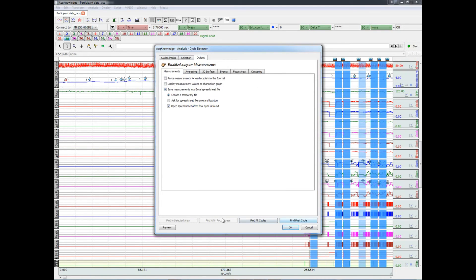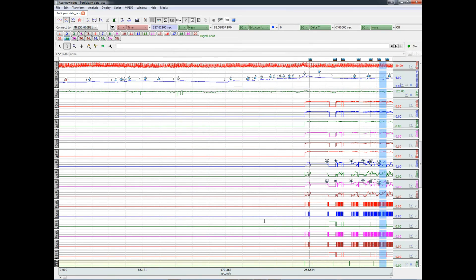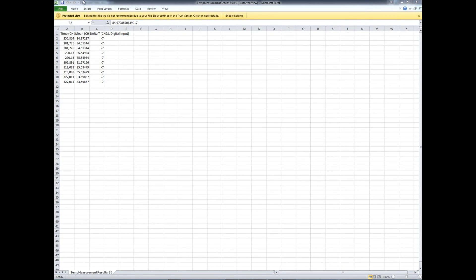Let's go ahead and look at the results. And we can see the time of each stimulus presentation and the mean heart rate for the seven second period that followed the stimulus presentation.